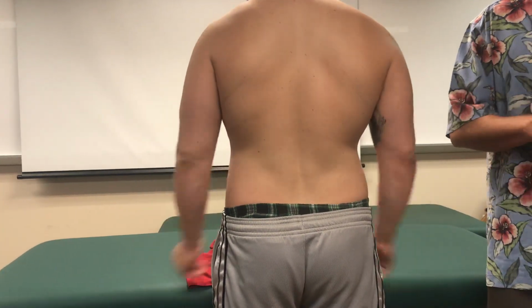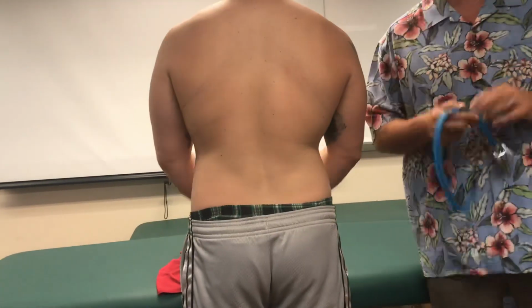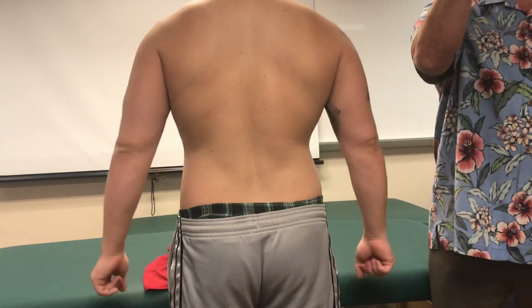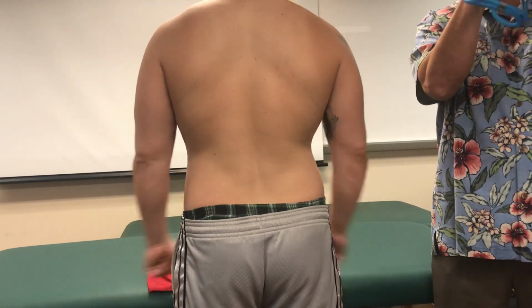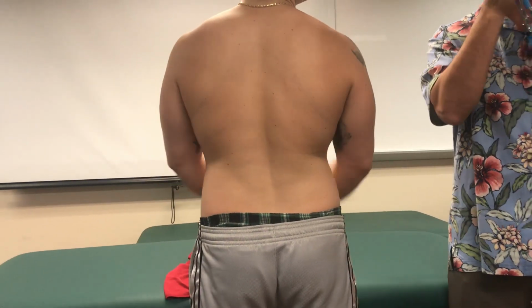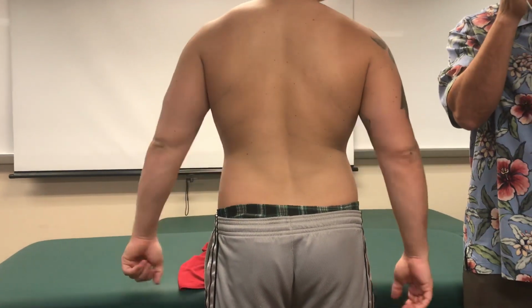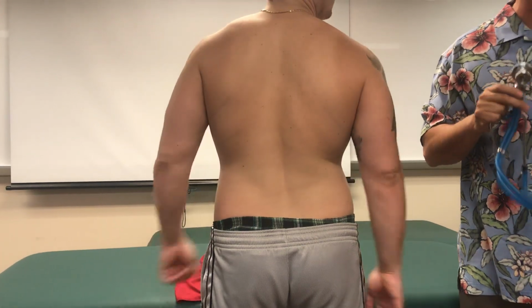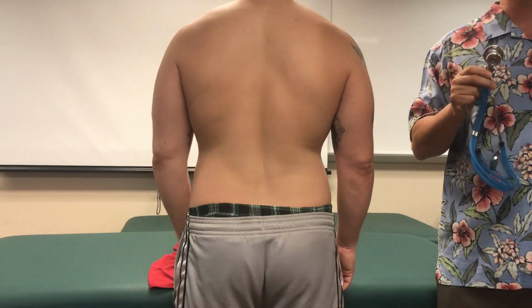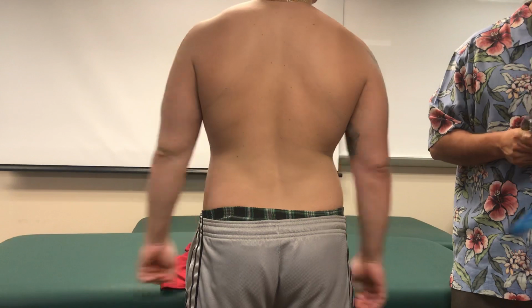Always ask permission whenever you're going to do anything. When I'm going to put my stethoscope on, I'm going to say, "I'm going to be evaluating your chest. Is that okay?" On this particular stethoscope, this is a diaphragm, and so is this. So if you had a smaller patient, you could auscultate with this one. It's a pediatric diaphragm. On some of your other stethoscopes, I think only the Sprague Rappaports have the two. The other one, I think, is a bell. You should be using the diaphragm when you're auscultating the chest.